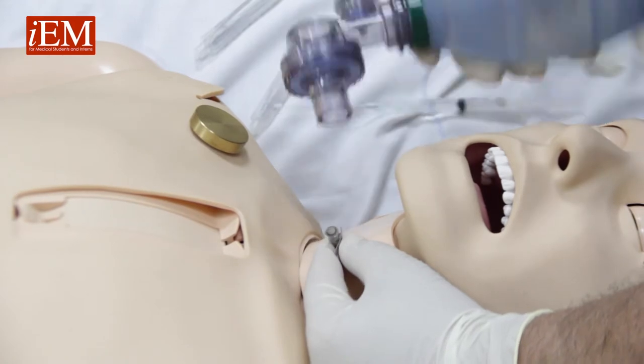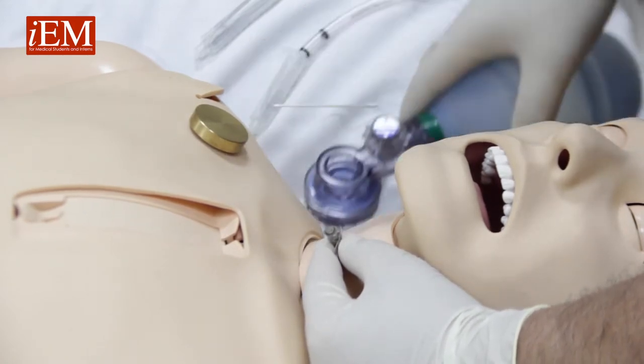Hold your catheter in place and remove the needle. Now we need to ventilate. As you can see, the Ambu bag is big and we cannot use it directly, but we have several options.